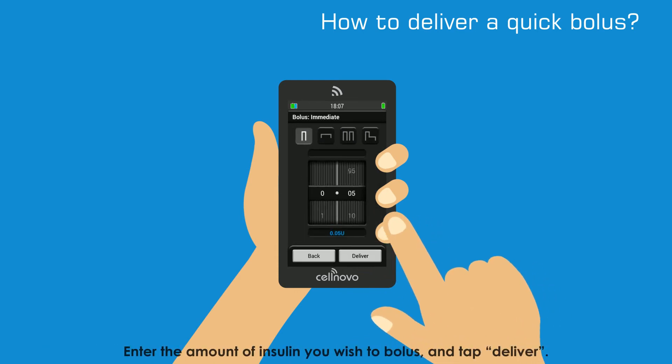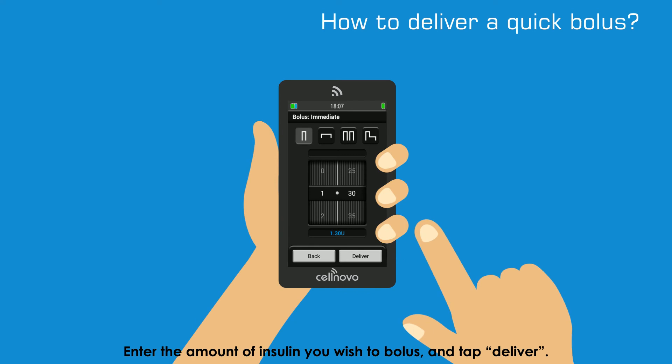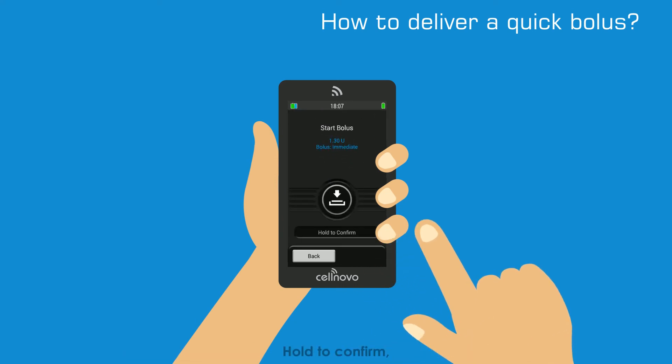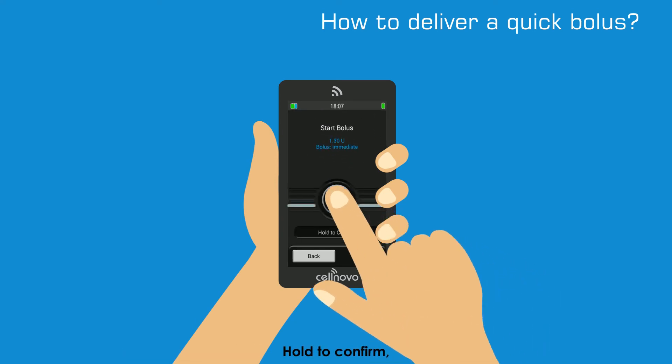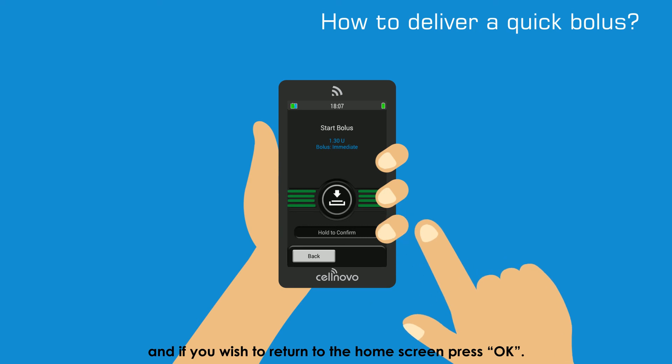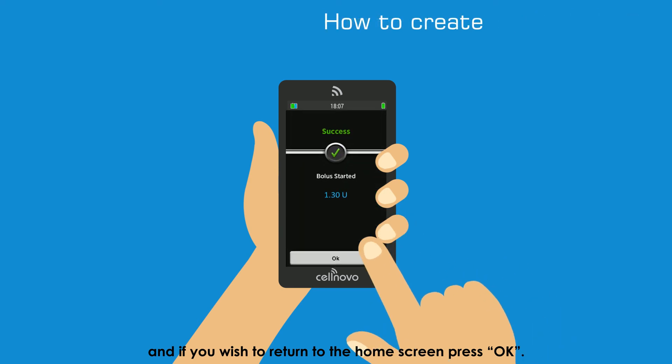Enter the amount of insulin you wish to Bolus and tap Deliver. Hold to confirm and if you wish to return to the home screen, press OK.